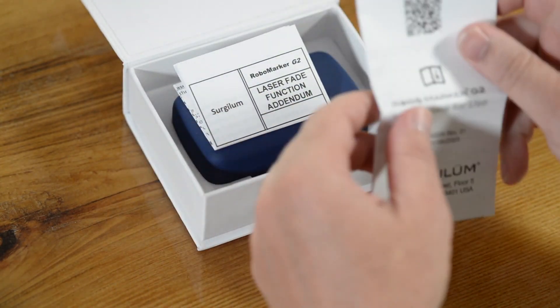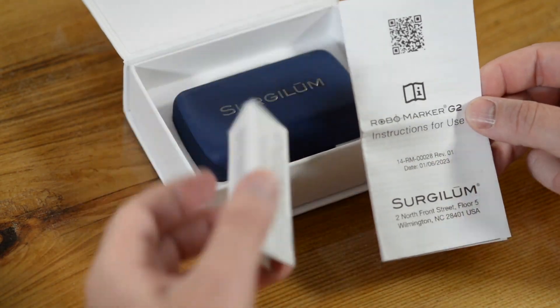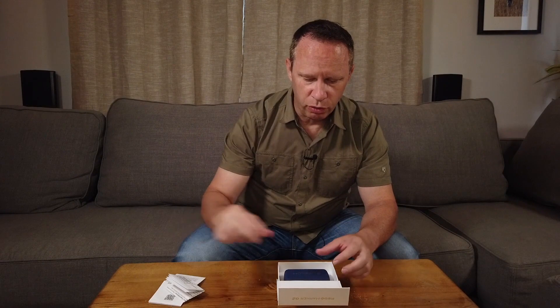We've got some directions for use — we're probably not going to read those, but we'll go over them in a little bit. Some warnings about lasers, we're going to put that aside too. And in this little blue box here is the actual Robomarker.